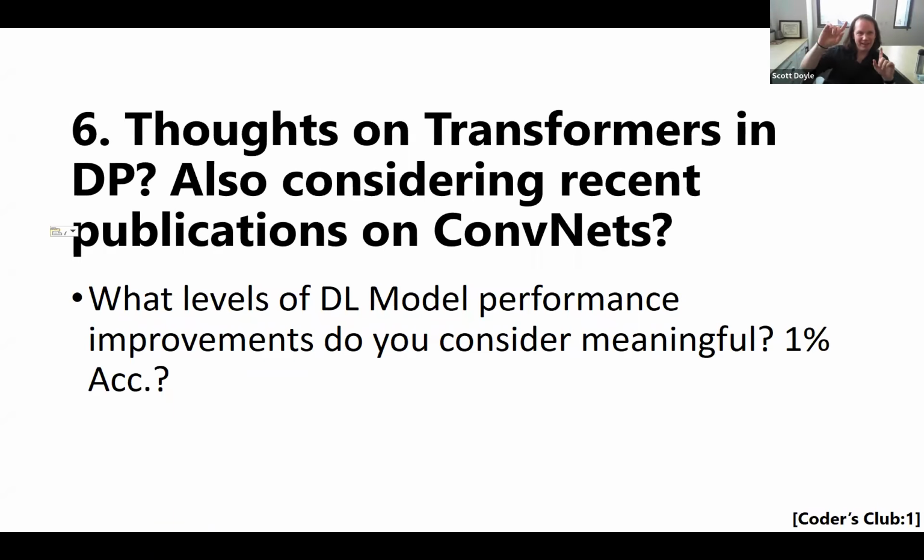Let me clarify just one thing. The 1% I was just referring to was segmentation performance, right? I think it's very different what you're actually classifying. Getting 1% of patients more accurate, that's a big deal. That actually is significant. If you show someone two different segmentation maps and they look basically the same, quantitatively they could be different, maybe even statistically significantly so, but that's a different thing from saying all of a sudden I'm classifying 1% of my patients more accurately. That's everything, right? That's what you should be focused on.